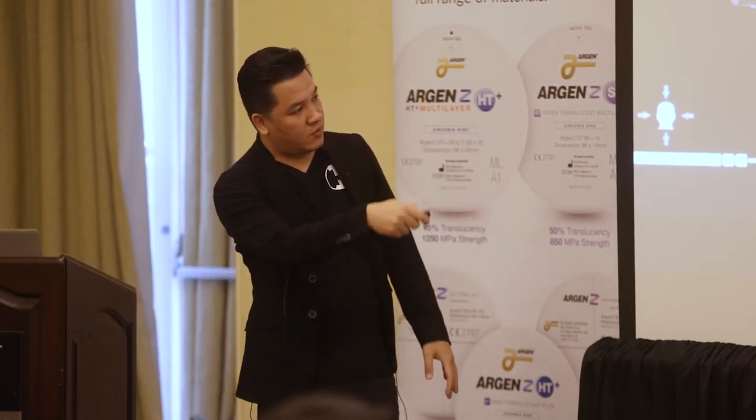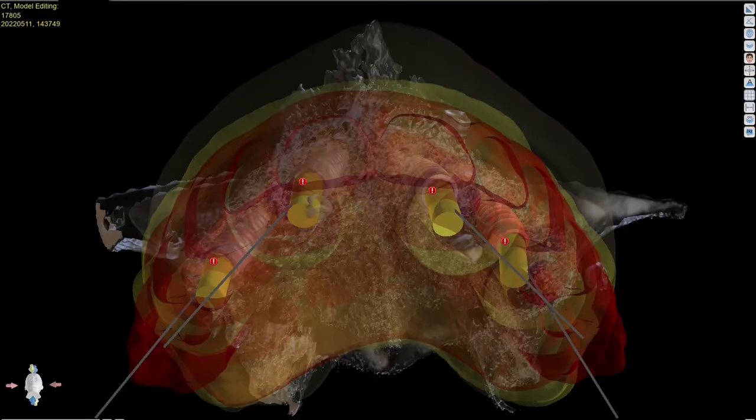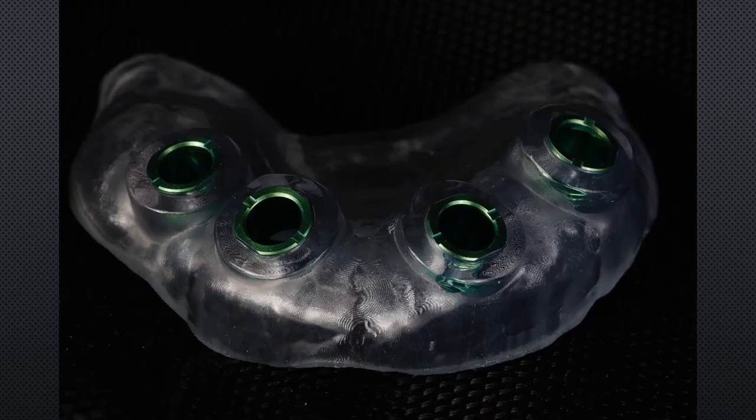And now you can visualize where these are going to come out of our imported denture as well. But what's really nice is you can also start to calculate your angulation on your multi-units. So we can tip it palatally so it's not interfering with incisal edges, it's not in the occlusal space. And you're able to take all this, bring it into software like 3Shape, and generate your surgical guides, put all those things in.